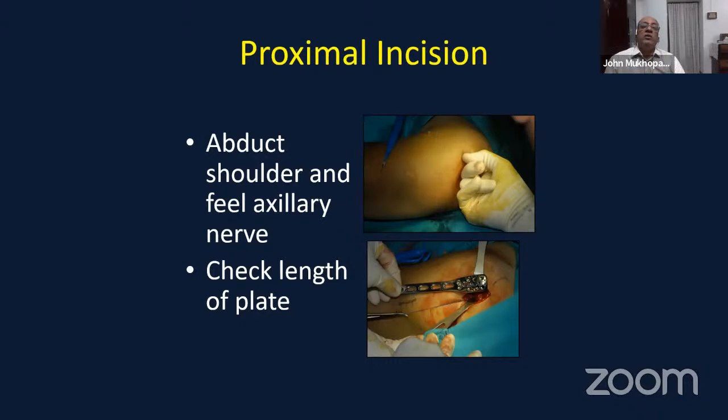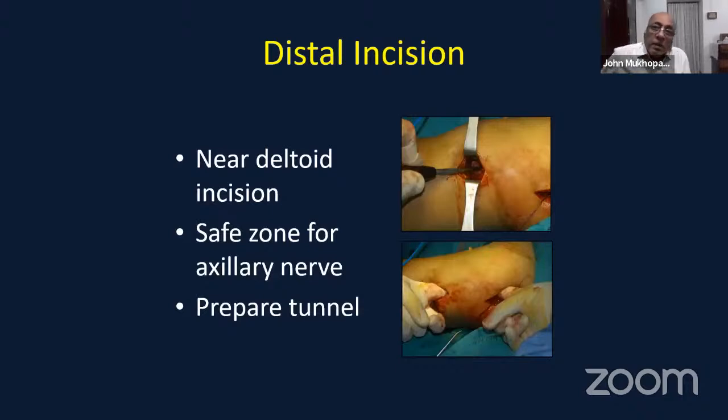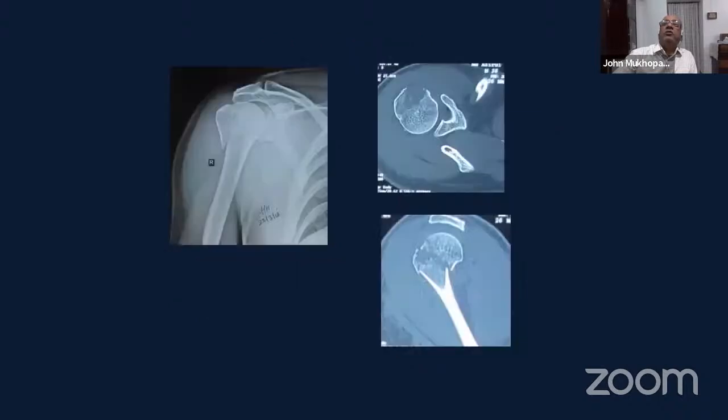We tend to just use some of the sleeves proximally, slide the plate down, and you have to be careful that the plate remains in the center on the lateral view so that it doesn't slide anterior or posterior. So feel the axillary nerve, abduct the shoulder, get your plate very close to the bone, and then gently pass it down. Make sure it's a slightly longer plate in most of these situations, okay? So you have to go down to the level of the deltoid incision and sometimes even go through the deltoid incision where you have to put a longer plate. You need to prepare the tunnel so that the plate can pass through without any problem.